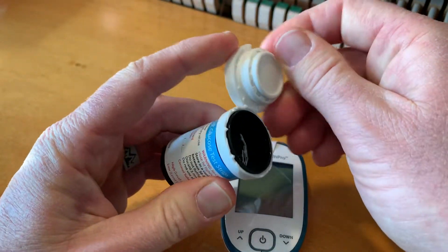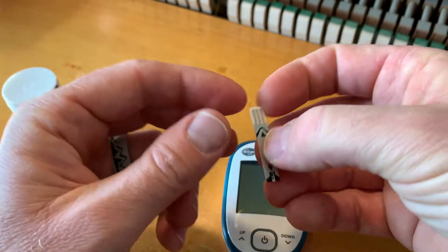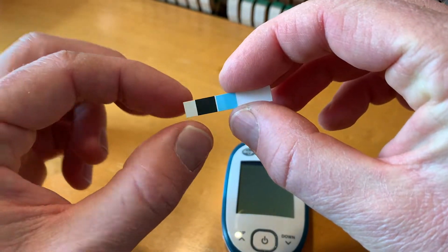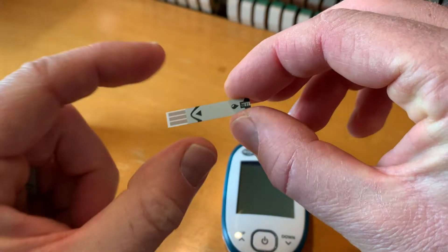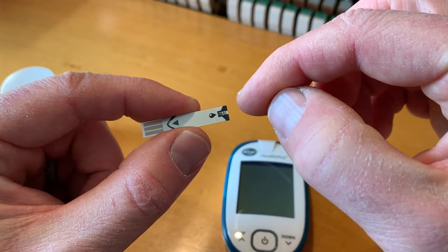Let me pull out a single strip from my pack here. Here's a strip removed and it has a couple of different sides. It has a side on the back with a couple of colors — you can disregard that side. And it has a side over here that has both a bar reader as well as a little blood indicator where the blood is going to go.